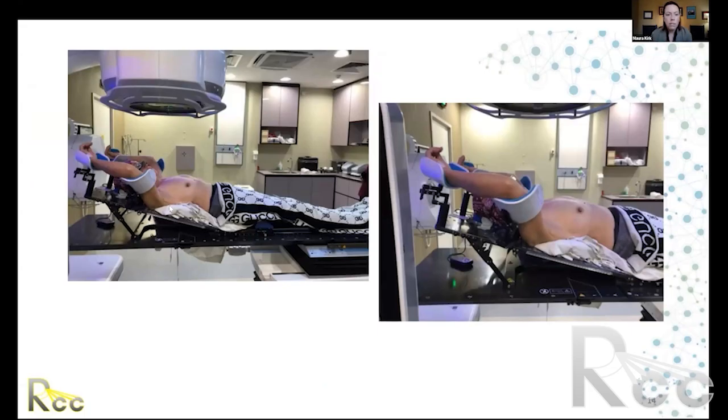One thing I noticed with this example was that it looks like for comfort, the patient has folded up blankets under their back. The board can be uncomfortable because you're laying on this very hard thing, but I would caution against something like folded up blankets under the patient for support, because the thickness and the angle of anything that you put behind the patient is really going to affect the breast and chest wall position. And this would not be something you would be able to reproduce easily every day. So you would really want the patient laying flat on here.